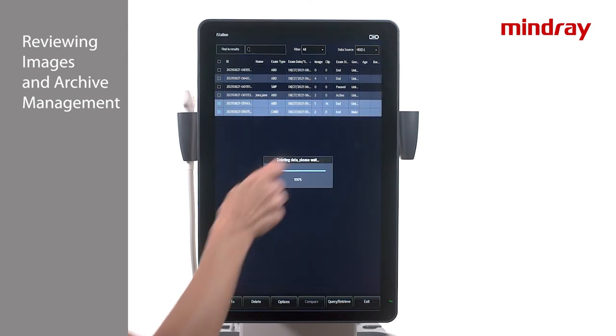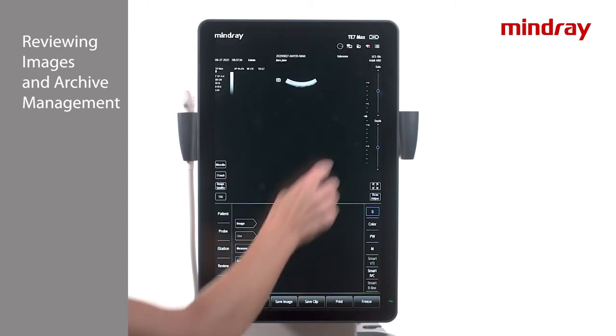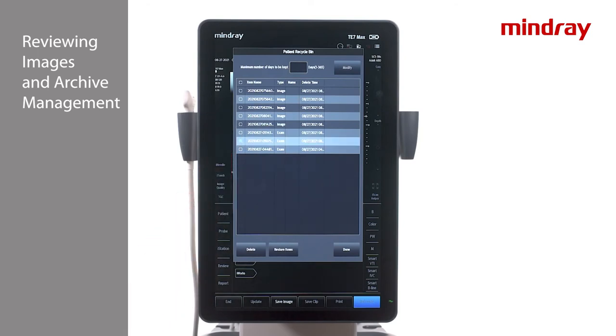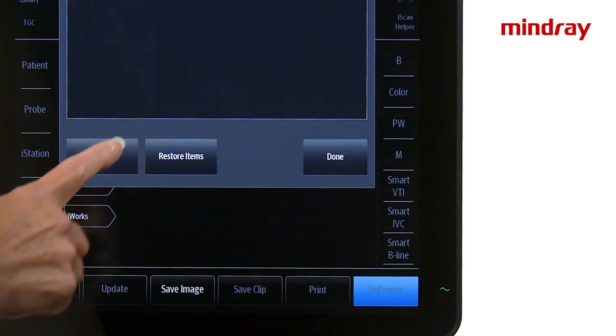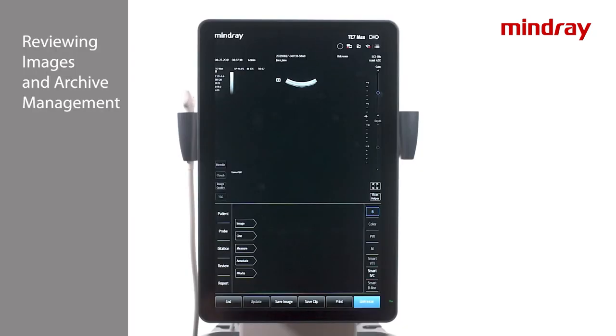The Recycle Bin is a tool used to retrieve accidentally deleted studies or images. Select Recycle Bin to view deleted studies. To retrieve a specific study, highlight that study and click Retrieve — this will send the exam back to the iStation archive. It is recommended that the Recycle Bin is emptied after deleting studies to keep the hard drive clear. An application specialist may set up the auto-delete feature to ensure the hard drive will never get too full.